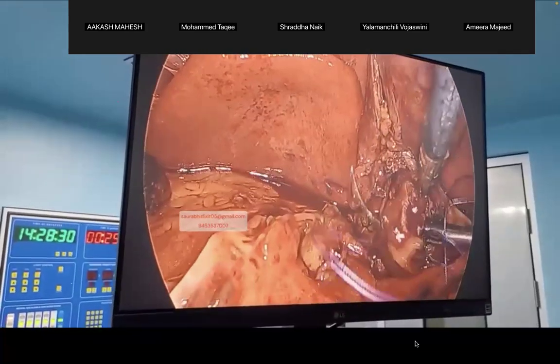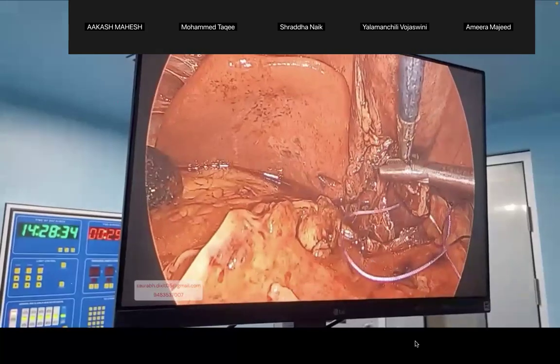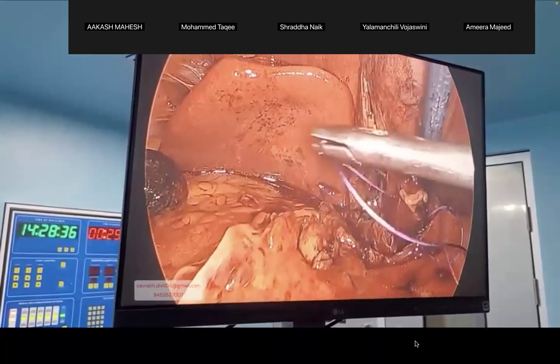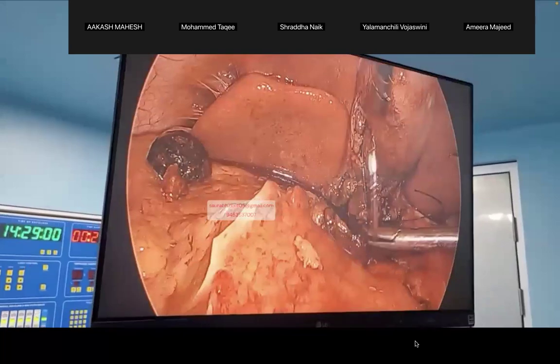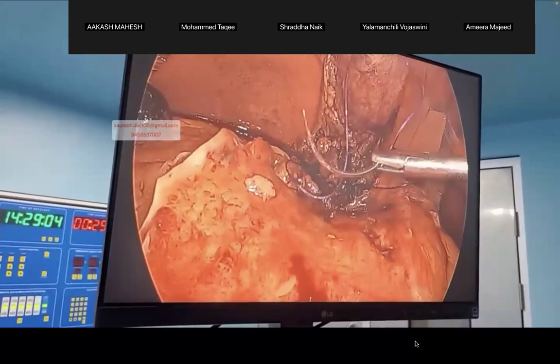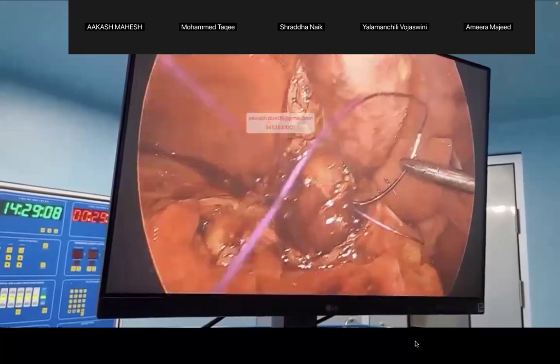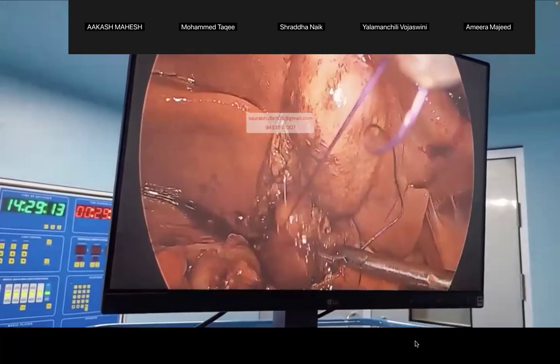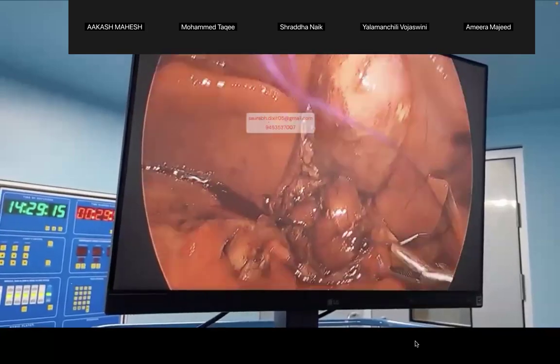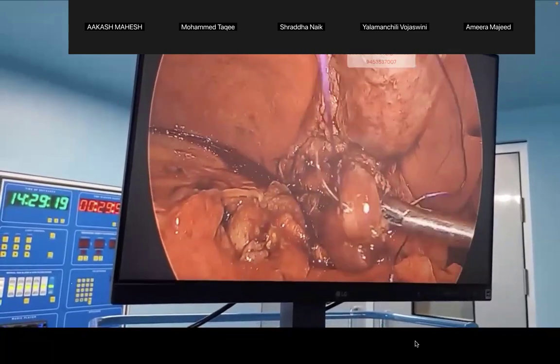Why am I not showing you that easy gallbladder? Because we are a high risk center. So we perform all high risk surgeries. So these are the surgeries which require utter precision. So if you see, we have done extracorporeal suturing also, and now we are doing a closure of the stump. And this is how the patients of Mirizzi's need to be treated. Otherwise, students, you will not be able.